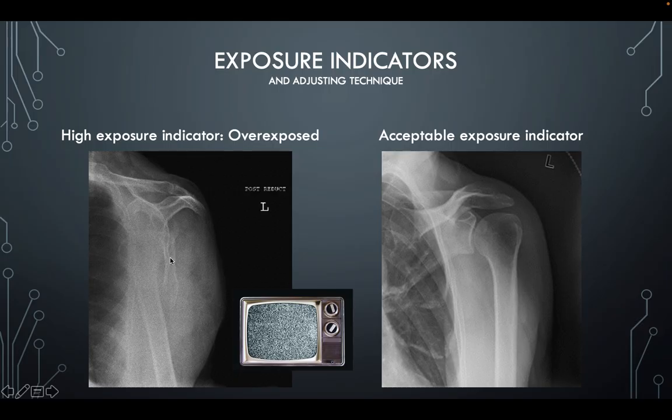So for this one, you would have to repeat. You can't see what you need to see here. You would need to make sure that you centered correctly and adjust your technique if necessary.